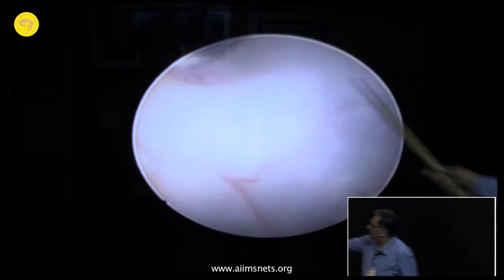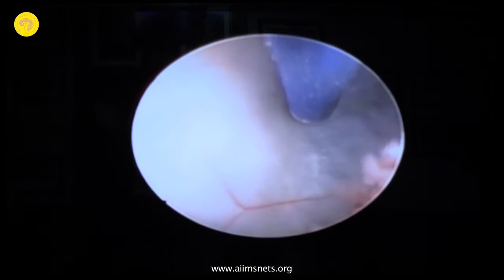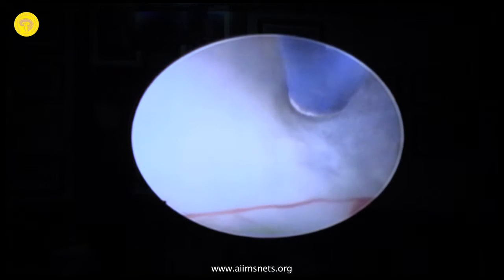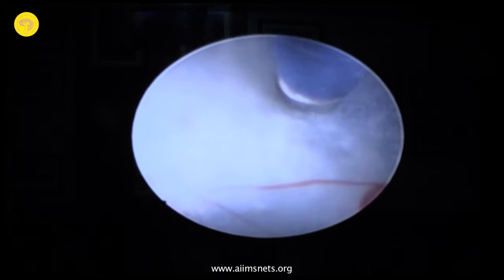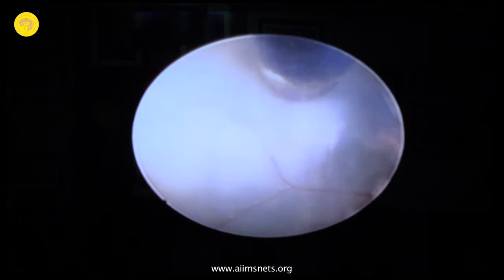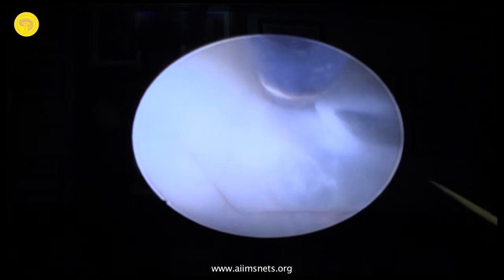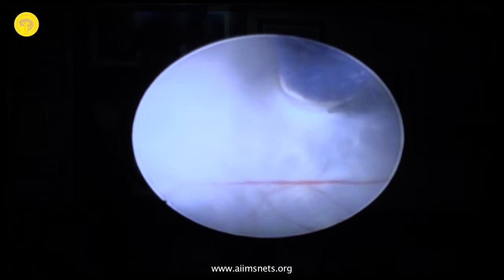So the important thing is to keep the trajectory there, and then you guide your assistant to actually reach the point. Many times I will have residents who've never done a single endoscopy, and I allow them to do this, and they feel very happy they're doing it, but actually you're doing it. So again, make some small monopolar openings, and it's very important to keep the choroid plexus away. So just do that.